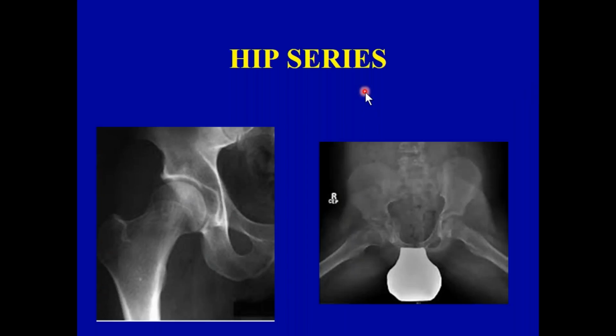Now we're at the hip. Normal hip, and I have to preface it the same way. There would have been a right marker on the original x-ray, and we want collimation, but now we can go back to our vertical axis, collimation on this side and on this side. This is a normal. The easiest way for me to explain hip radiographs is, patient, put your finger on your underwear line, and that's where you aim. And when you aim there, you're going to be halfway between the greater trochanter and the lesser trochanter, somewhere in this plane. This is somewhere halfway between this point and this point. So underwear line.